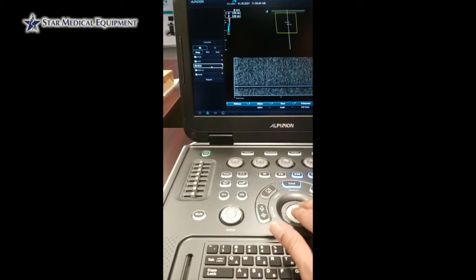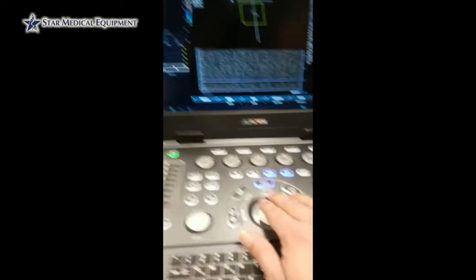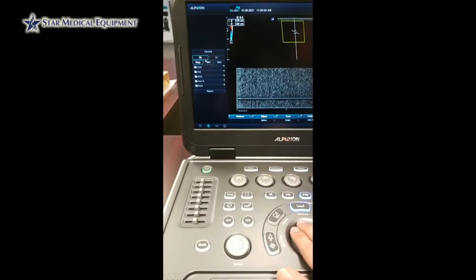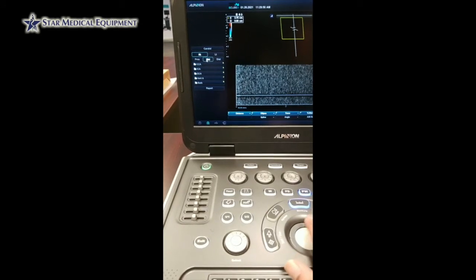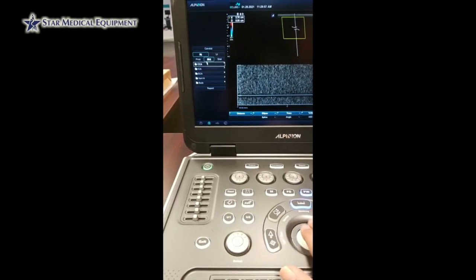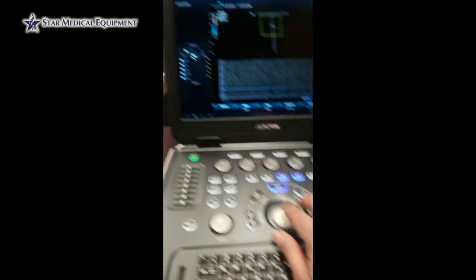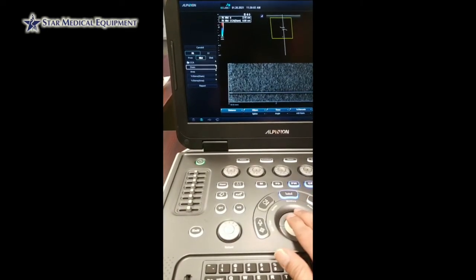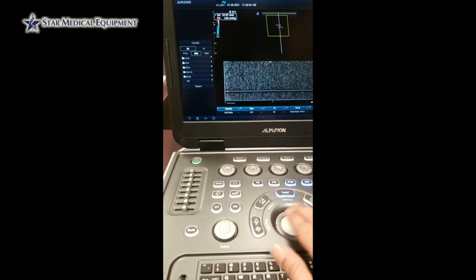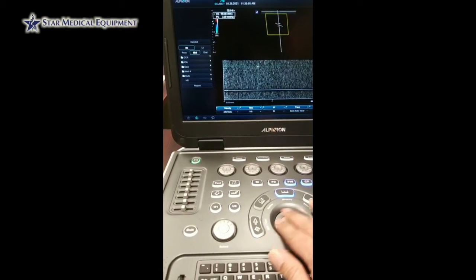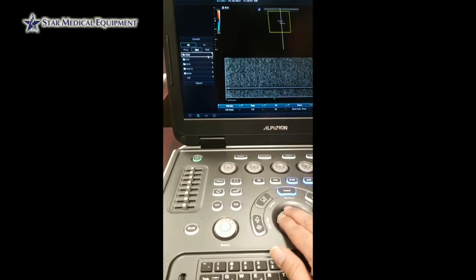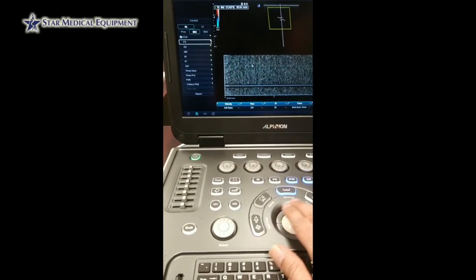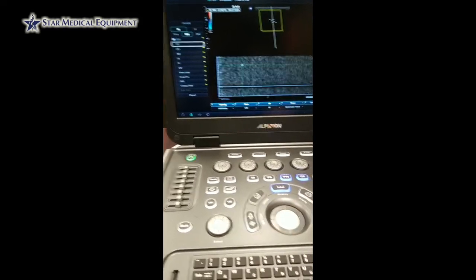It also shows ICA, ECA, vertebral artery, and the bulb, so I can choose whatever I want. Let's say I want to do the right mid CCA — I press on mid with the set button, then CCA, and as soon as I take my cursor down there you will see what happens. It's automatically set to peak systolic.